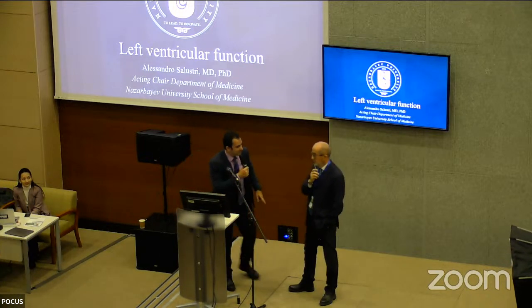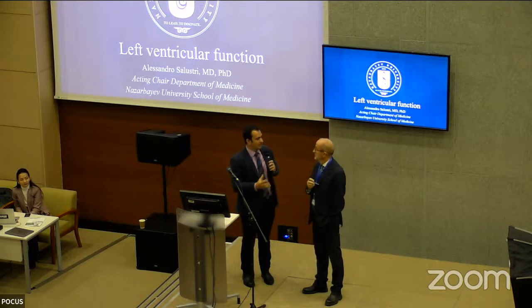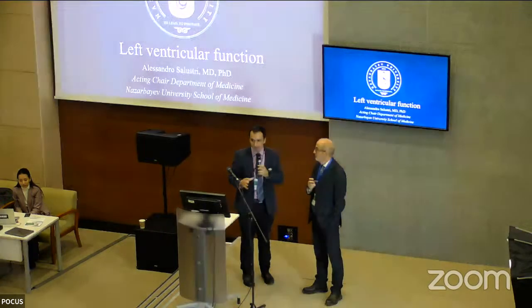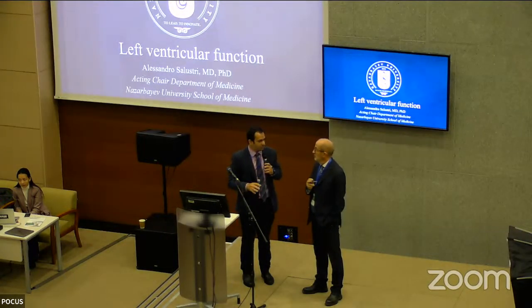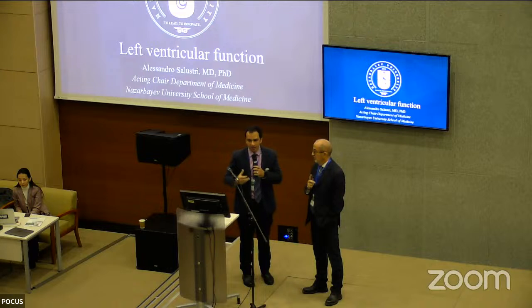Exactly for the same reason, ejection fraction is not validated in hemodynamic instability. So depending on the context, if you're a cardiologist in outpatient clinic, ejection fraction absolutely is one of your parameters. But if you work in emergency, in critical care, you're dealing with shock, we don't use ejection fraction because it will not tell you much about perfusion.